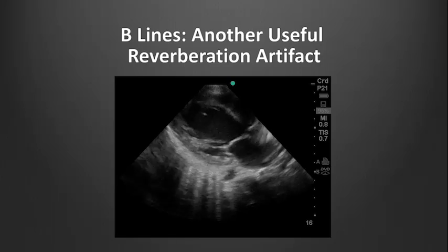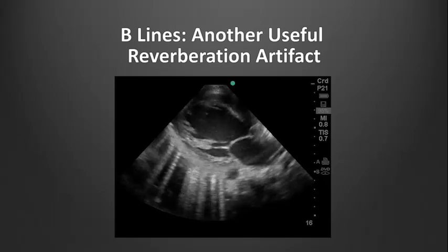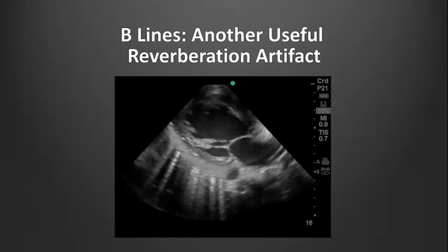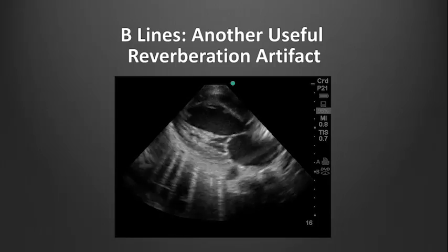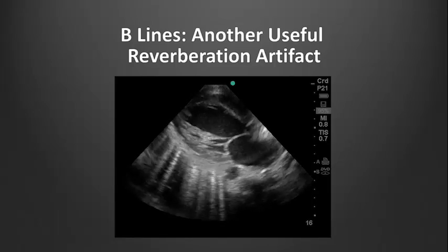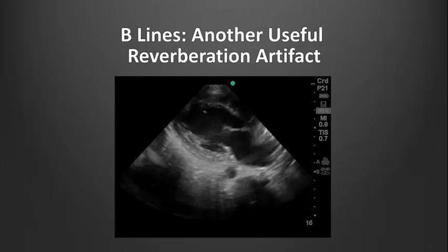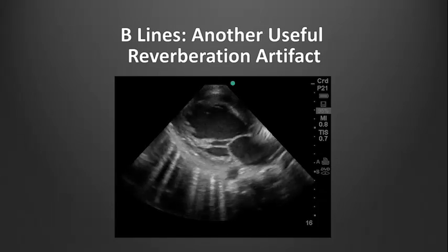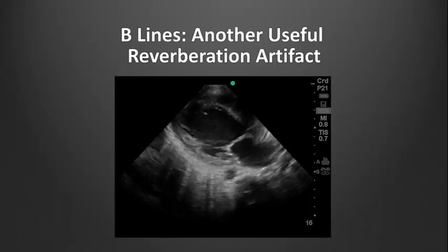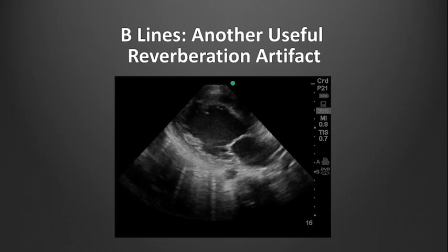These are B-lines, echogenic lines extending vertically from the pleura to the bottom of the screen that move with respiration. B-lines do not tell you what is causing the alveolar filling or interstitial thickening. Pulmonary hemorrhage or interstitial syndromes such as pulmonary fibrosis can also cause B-lines, but in our clinical case, the many B-lines suggest a CHF flare may be the cause of this patient's dyspnea. A diffuse A-line pattern would instead implicate his COPD.